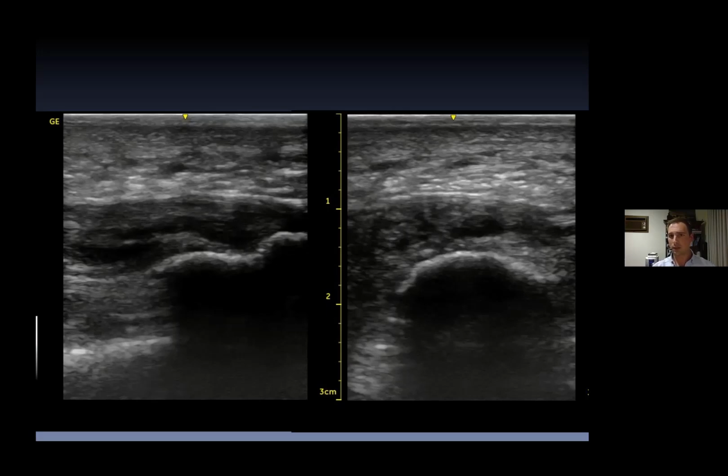That's where I'm tending to put most of the energy. So you are going to be treating in that area. I was talking more about the effect that it's going to have. It's going to have an effect on the fascia. It's going to help with that. It's unlikely to change the shape of the bone or anything like that. But yeah, I would still be treating that, again, to palpation pressure as well.